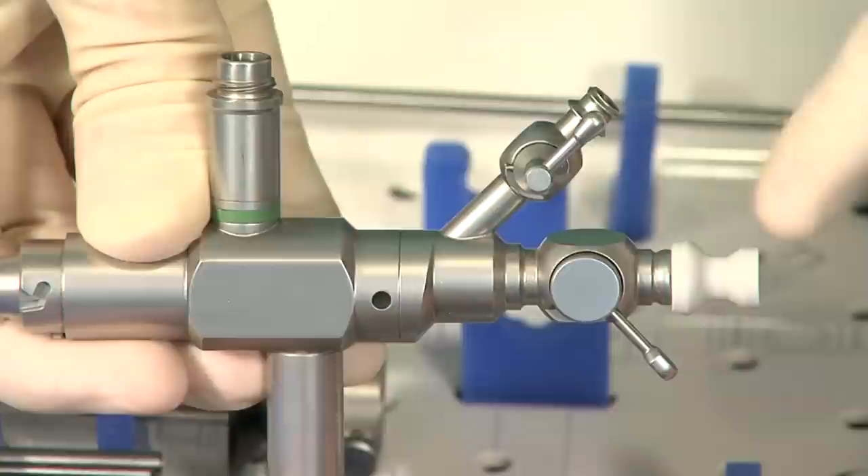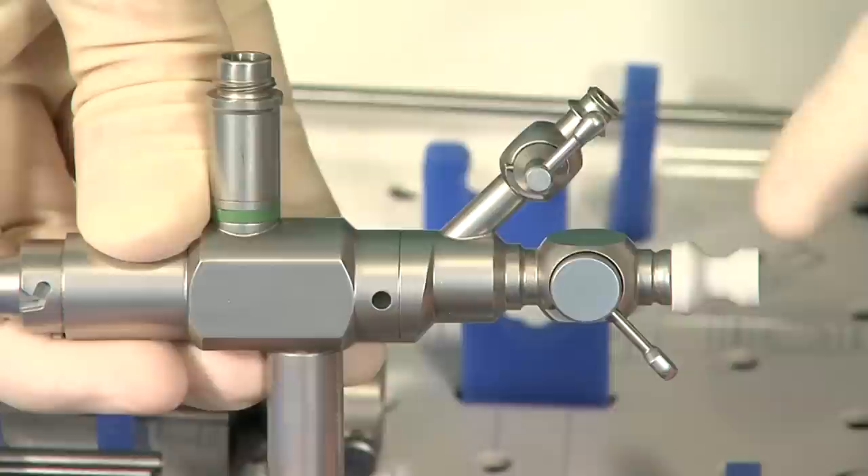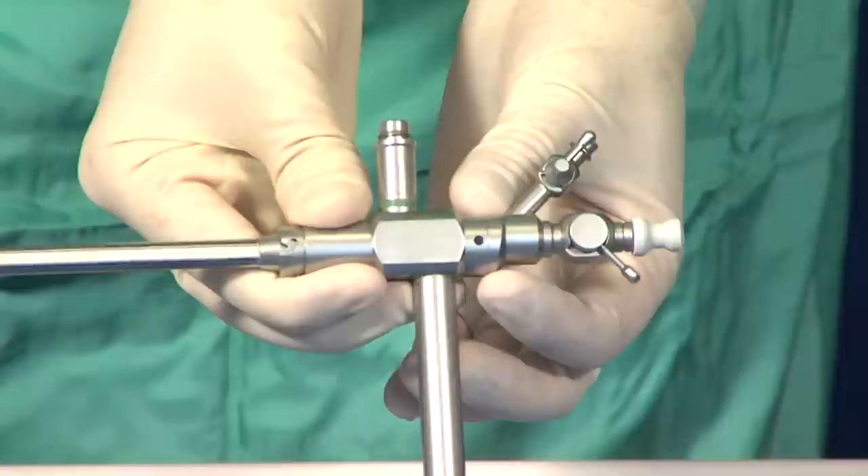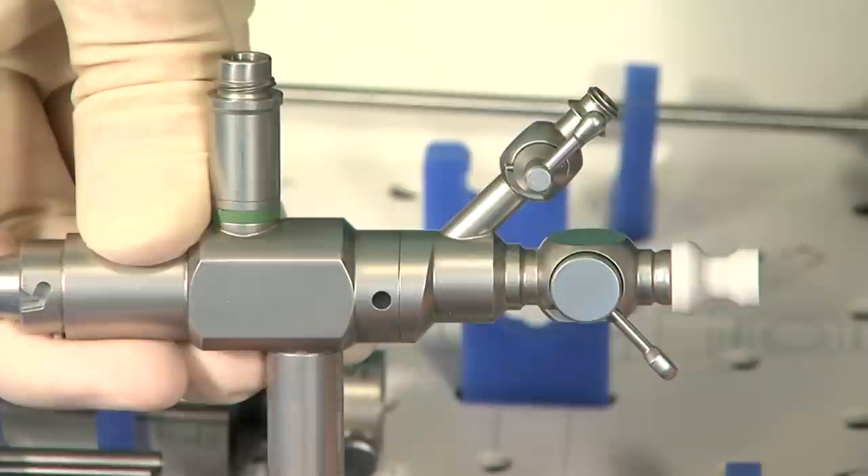It is equipped with a valve and a removable seal for ensuring that the operating channel remains leak-proof, even when this channel is being used with an instrument. In this way, the uterine cavity can be maintained in a distended position. A luer fitting is used for connecting the device to an irrigation system.